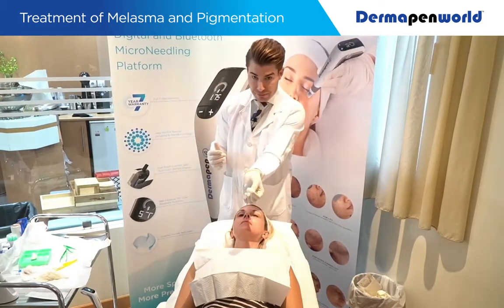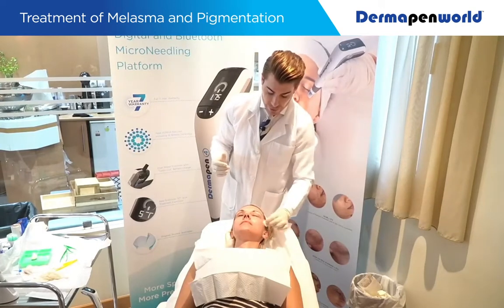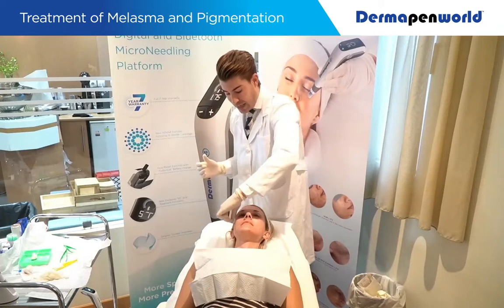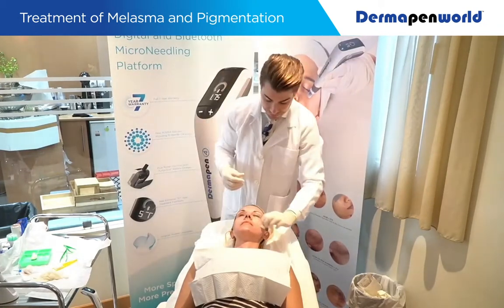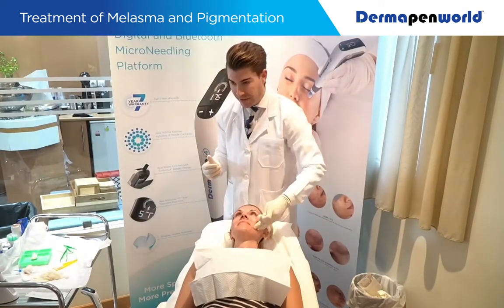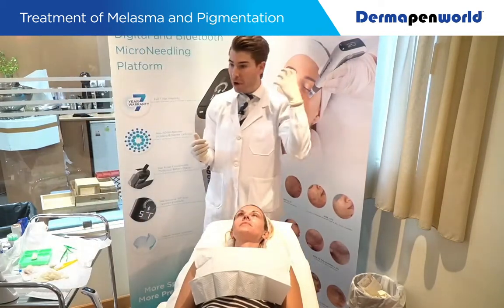There's no blood. So you can see that the puncture channels, when the mask comes off, have already closed. So the skin is pink and the skin will continue on getting better. Nothing will get worse than this. So at the moment, there's a little bit of heat still in the skin, but the skin's not on fire.